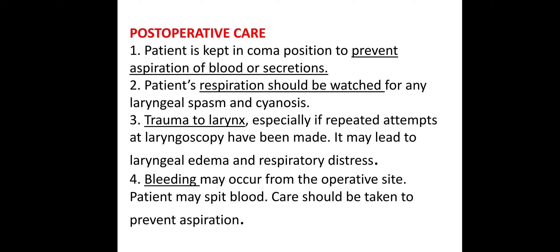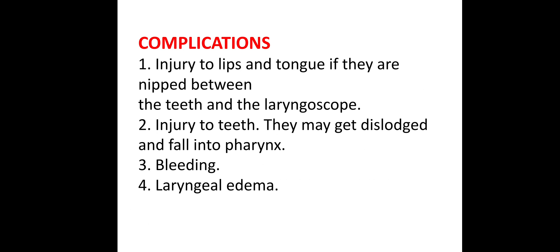Trauma to the larynx, especially if repeated attempts at laryngoscopy have been made, may lead to laryngeal edema and respiratory distress. Complications include injury to the lips and tongue if they are nipped between the teeth and the laryngoscope, injury to teeth which may dislodge and fall into the pharynx, and leading to laryngeal edema. Bleeding may occur from the operative site and the patient may spit blood; care should be taken to prevent aspiration.